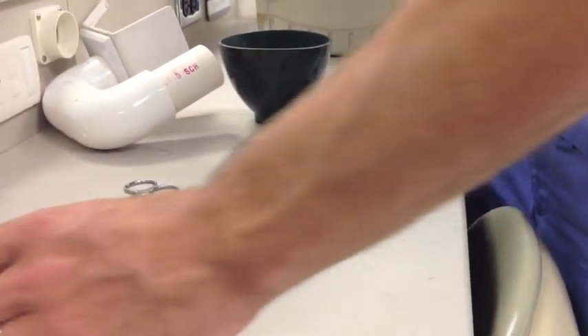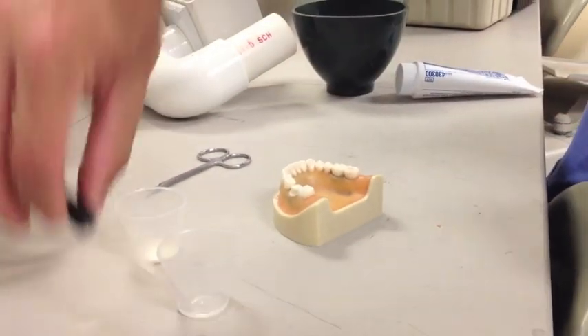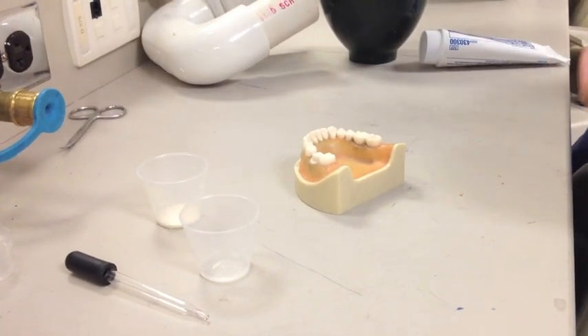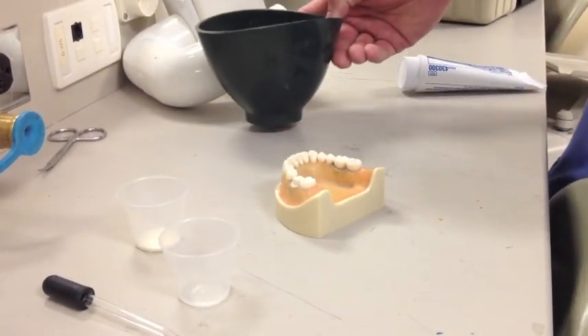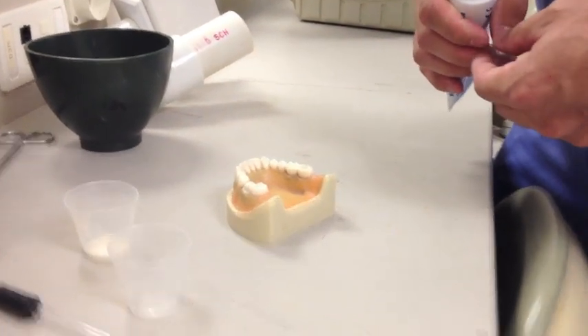We also have our liquid monomer and our polymer here, an eyedropper, and a bowl of water. This is the Dr. Donaldson method — they don't usually tell you that in class, but it's a big help. We'll get to that in a second.